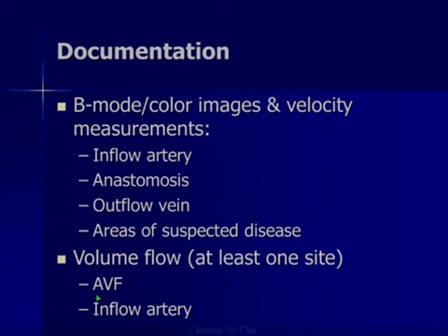What we need to document is images, of course. We're not all about Doppler. We're going to take some color or grayscale images of the inflow artery, anastomosis, the outflow vein, any areas where we suspect a problem, and velocities at those same levels.